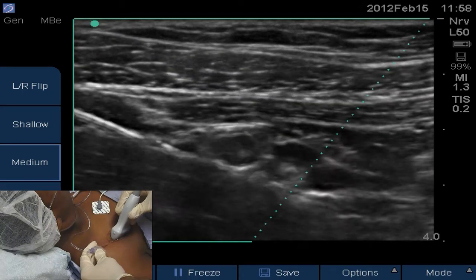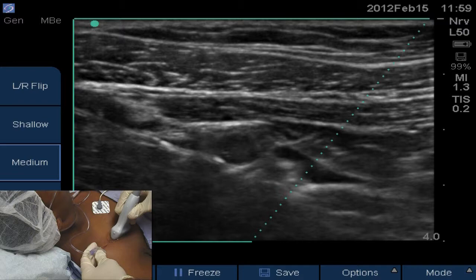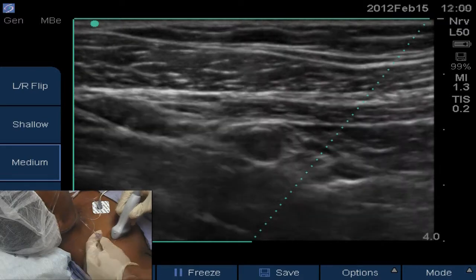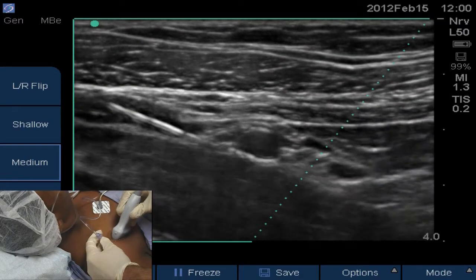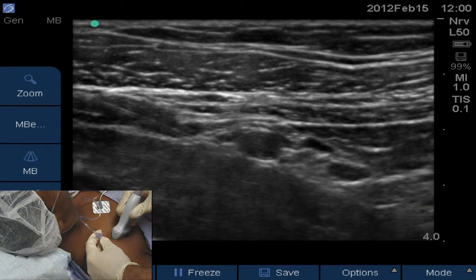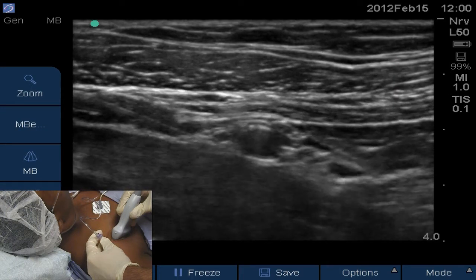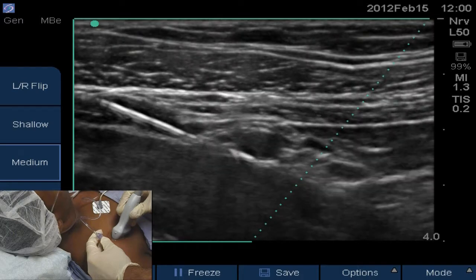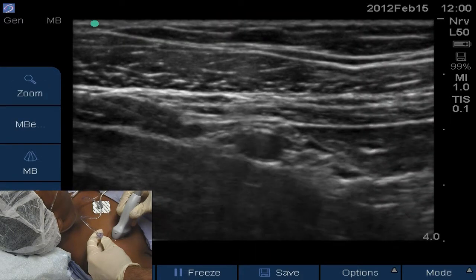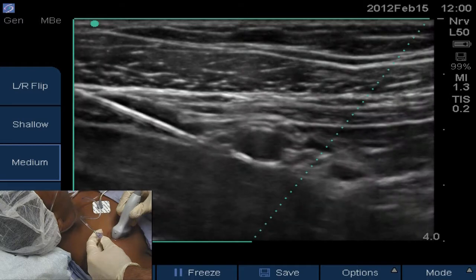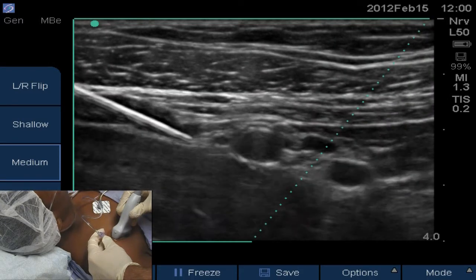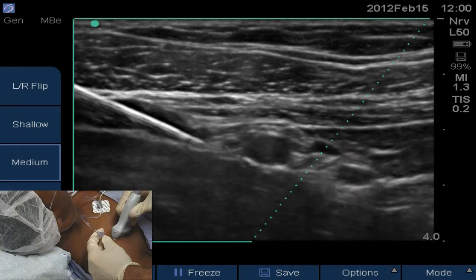We'll do it on and off a couple of times to try to enhance the ability to demonstrate the difference. Turn off the needle visualization software — turn it back on again — off — and then back on again. You can definitely see a difference. We're going to have you aspirate and get five cc's, leaving the software on.